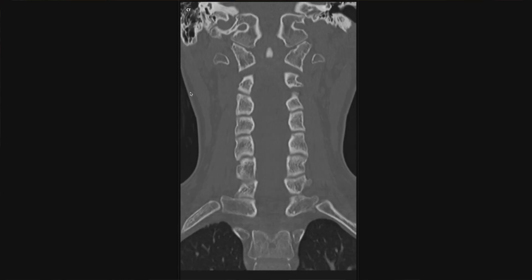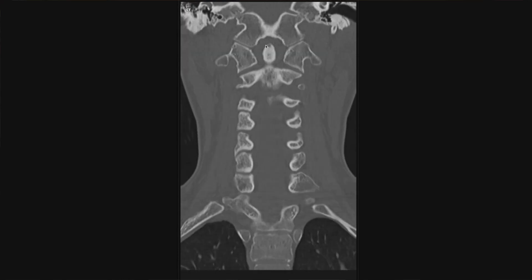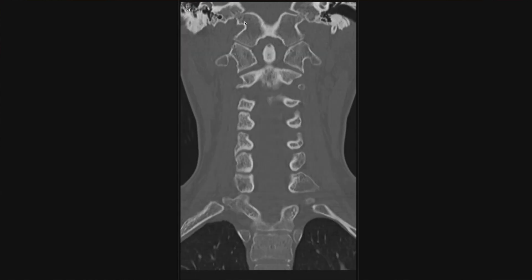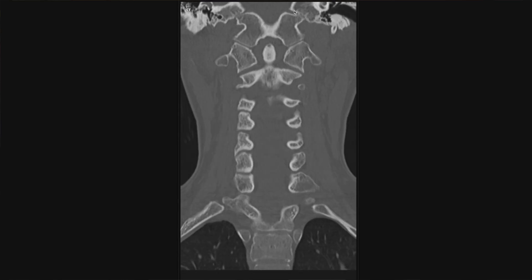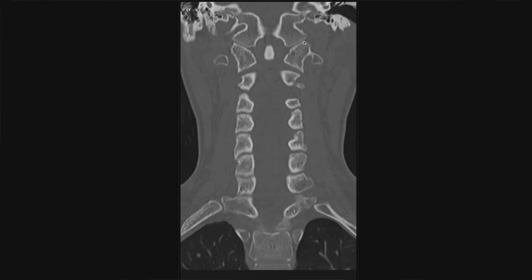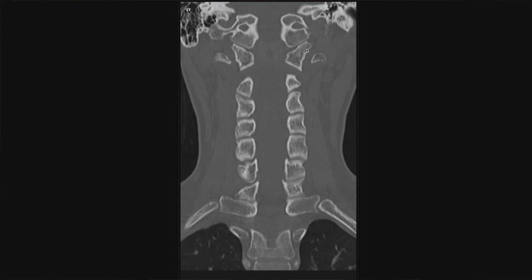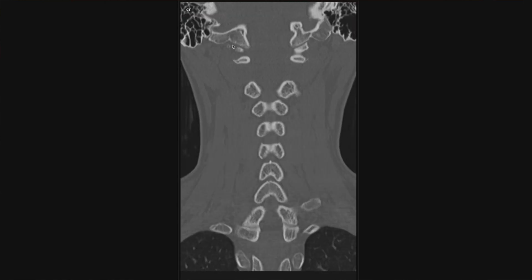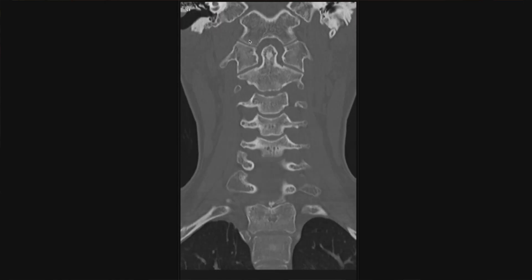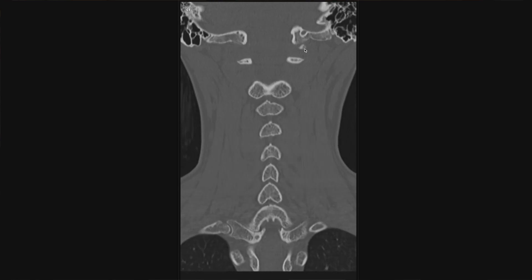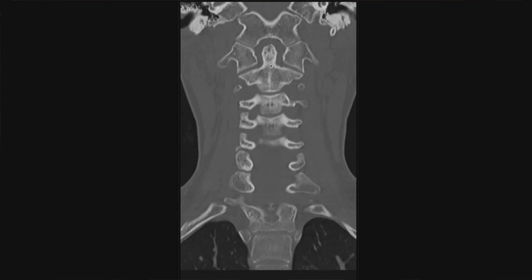I take a look again at the occipital condyles in the coronal — this is a good view to catch an occipital condyle fracture. Here are our occipital condyles up here, articulating with C1. These line up very nicely and I don't see a fracture. I then go a level below and look at the articulation between C2 and C1.